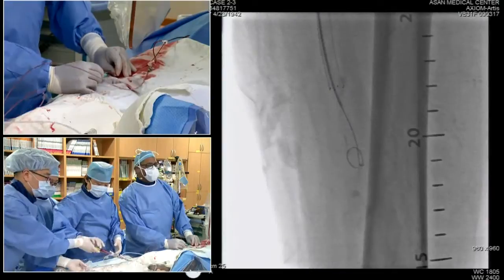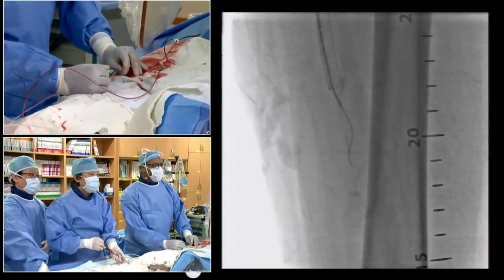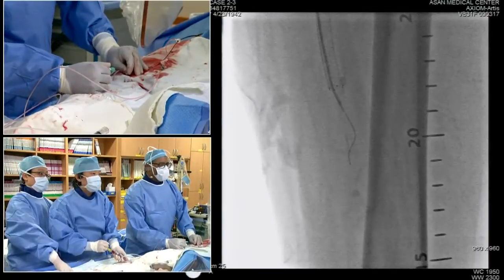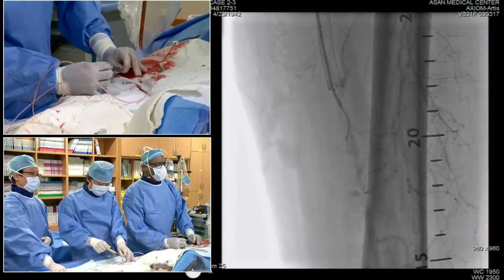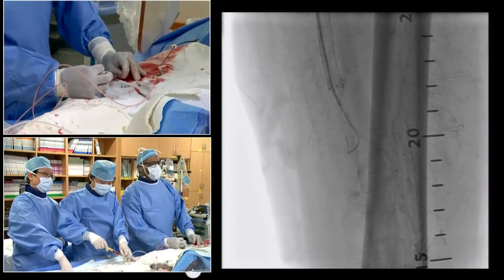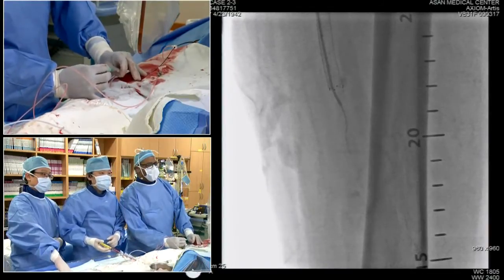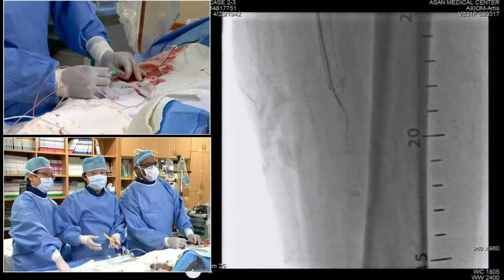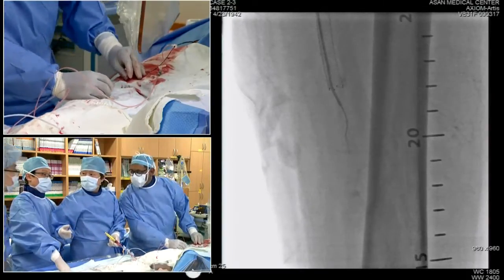I think a drug-eluting balloon would be nice to have here, particularly for in-stent restenosis or occlusion. I think if you're going to go down the road of having to re-enter and the difficulties he's having, you're obligated to stent the outflow. We have to try something different, because all we're going to do here is extend this. Ultimately, the answer I think is going to be a stent technology here.